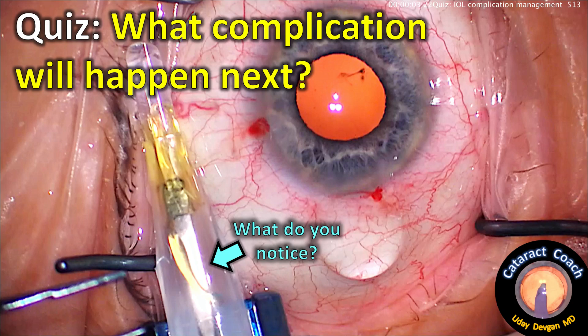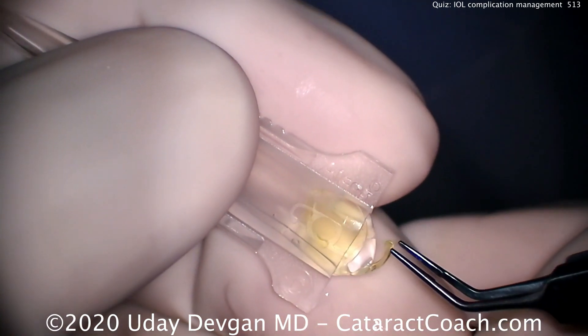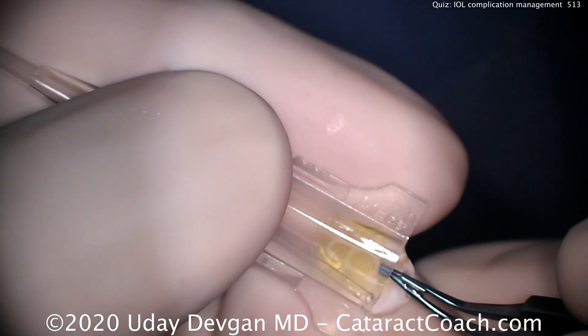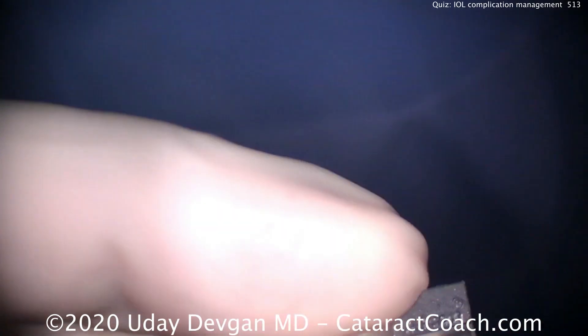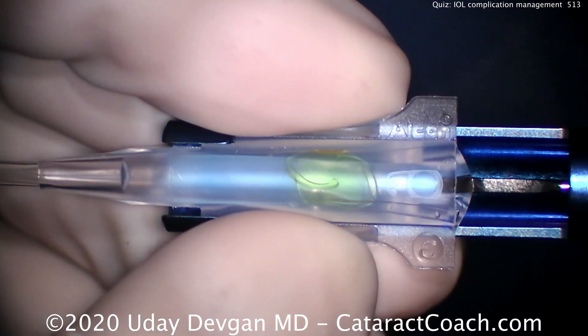cataractcoach.com — quiz time! What complication will happen next? Look at that arrow, what do you notice? Let's look at this case in some detail. Loading up a lens here — it's a single-piece acrylic lens. Placing it in the injector, putting both haptics on top of the optic, let's push this down the barrel. That looks pretty good — we're going to put this into the injector and click in the cartridge.